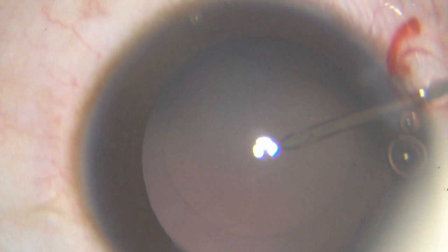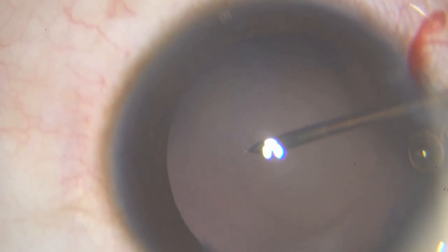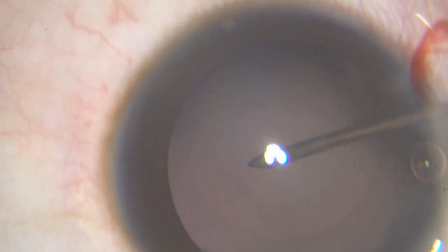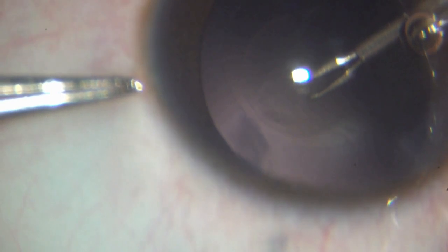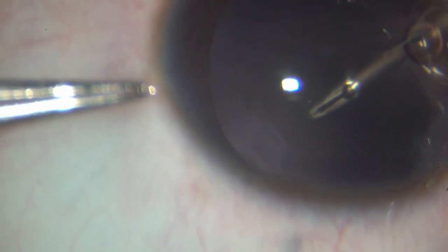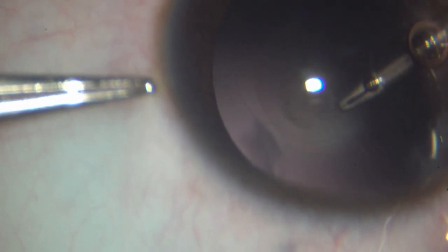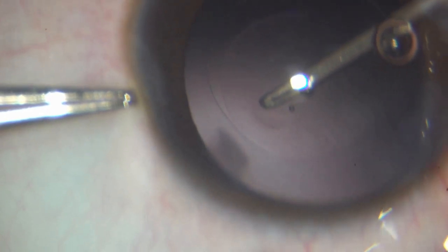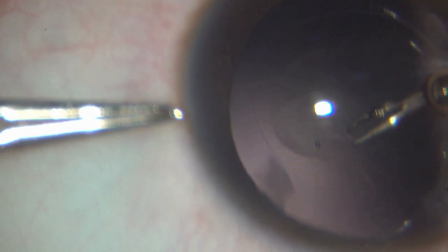The central reflex is giving me a little problem with visualization, so I am taking my time over it. I do get it and I am slowly injecting — you can see it being injected. There, that's the separation, and you can see that beautifully separated central hole. For better visualization I have turned off the coaxial illumination. I don't want to break the anterior hyaloid with the capsule forceps, so I catch just a bit carefully, going very slowly. Got the capsule — making a flap. You can see the flap tearing; now I can see the flap well.